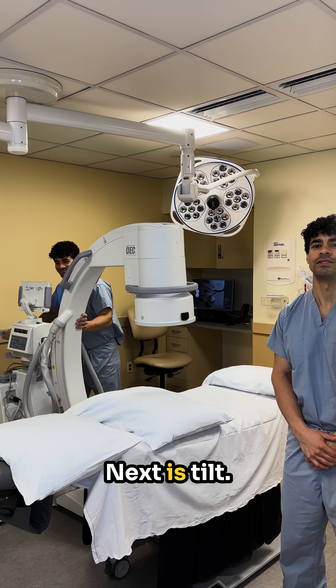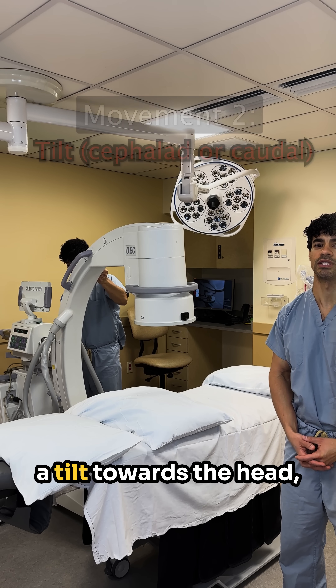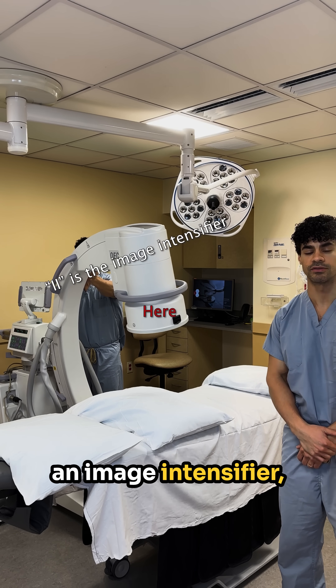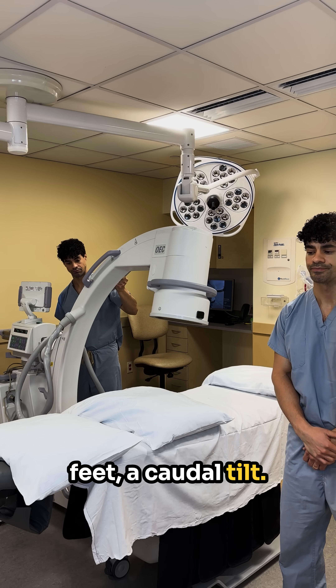Next is tilt. You can have a cephalad tilt — essentially a tilt towards the head in reference to the I.I., the image intensifier — or tilt towards the feet, a caudal tilt.